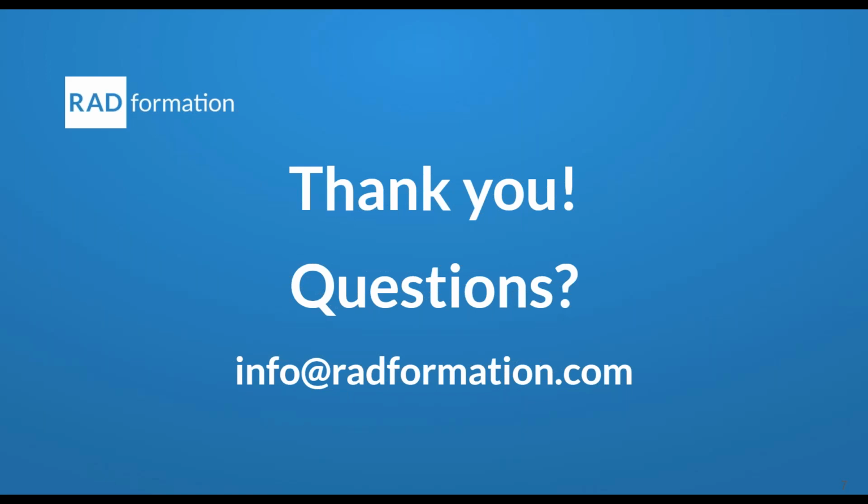So here's another one asking about all of the different points that you're using in the log file analysis. Can you evaluate more than 250 points? So currently, no. We've set it up that way just to make sure it's not super slow. But it's something that we're always looking at improving and making better. The reason that we picked the 250 is because that's the same resolution we use in the calc. So to make those cross comparable, we also have to increase the resolution on the calculation side, which would make the calcs go a lot slower. So for us, it's a trade-off between getting you results quickly and meaningfully without unduly slowing down the calculation itself. So it's always this trade-off on that resolution front. But that's why we stuck with 250.